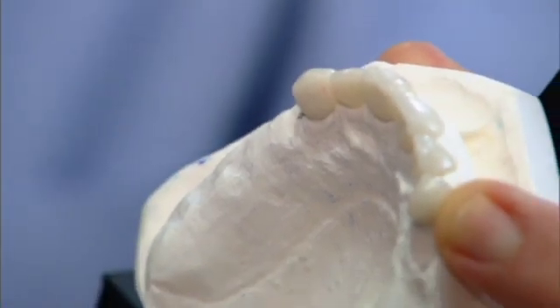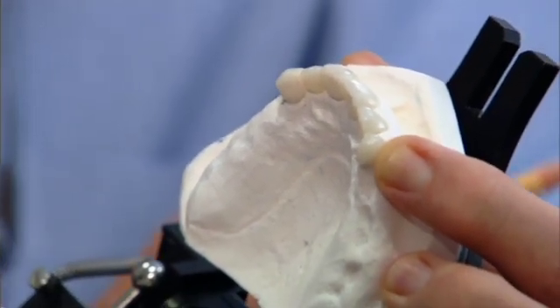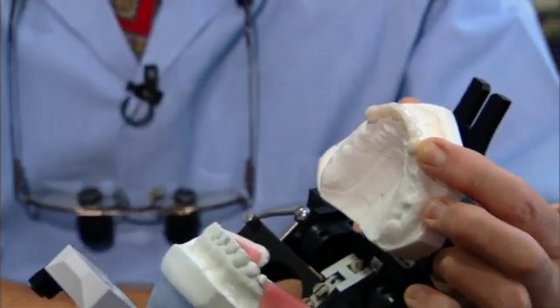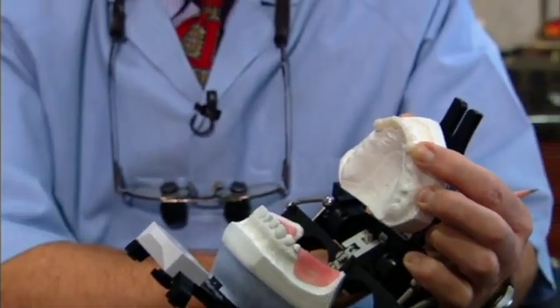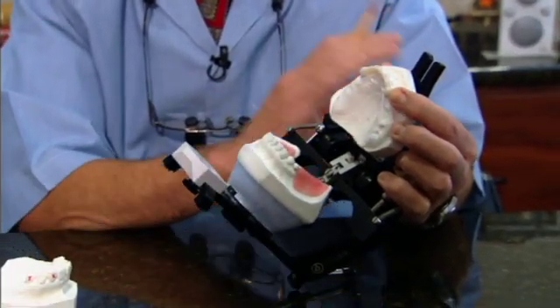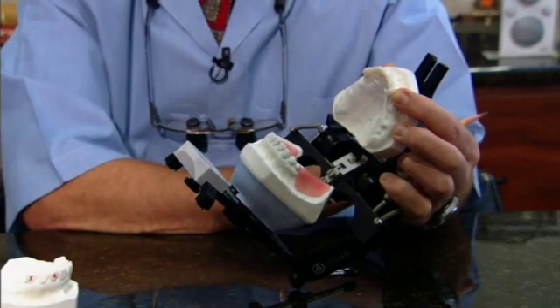So with this discovery, we're able to head off problems down the road. I can't tell you the number of people who will tell me, oh gosh, we got to the end of the case and didn't have enough room for the attachment. Well, that's not the time to find out that you don't have enough room. The time to find out is during this phase, when you can do something about it.